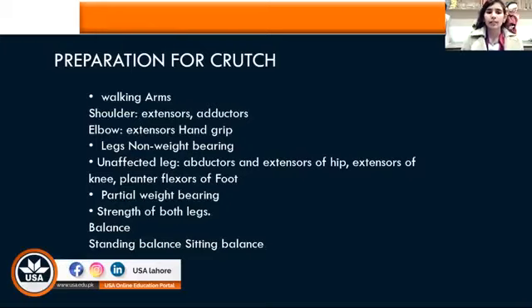And after that, balance is the key. Balance in standing and balance in sitting should both be pre-tested and prepared before the patient starts walking on the crutches.